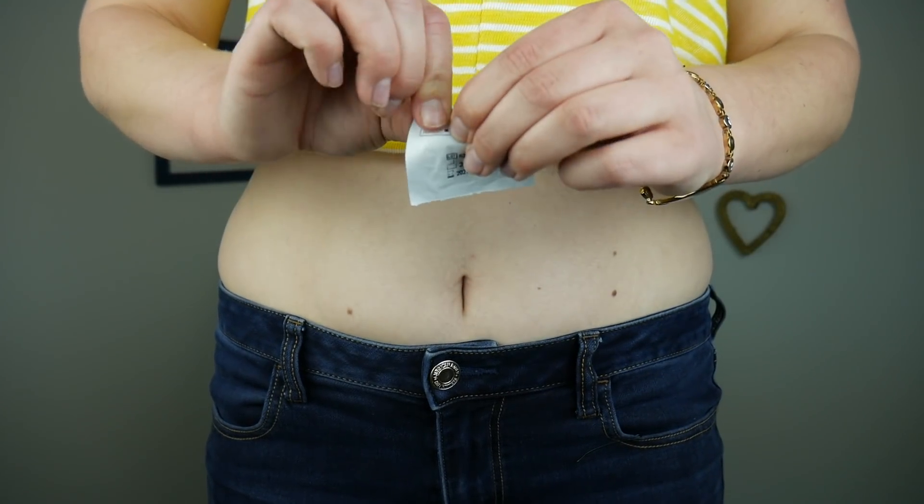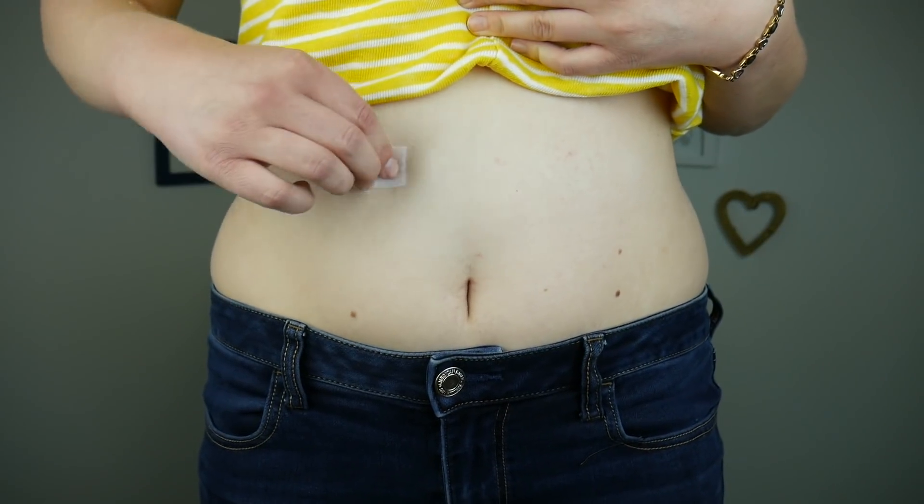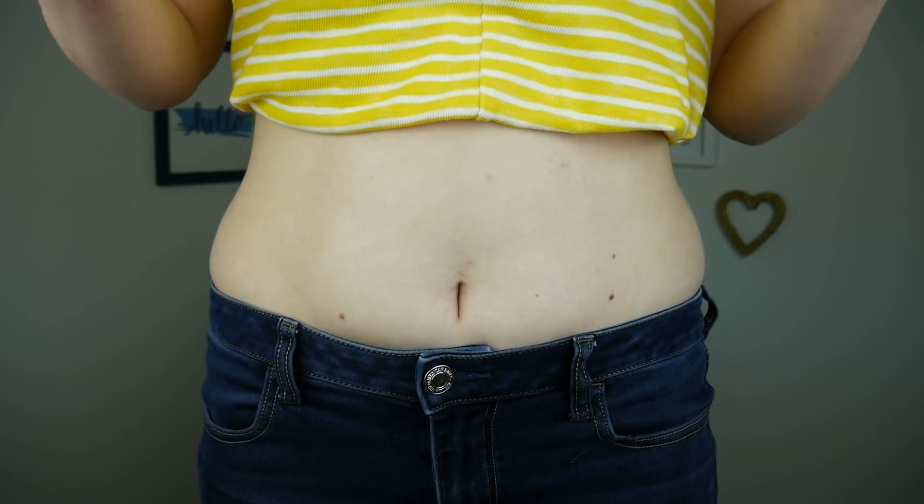So first you just want to clean the site with alcohol and let that dry. Now I have to enter the sensor serial number into my app or receiver, and it's just written on the very bottom of the adhesive backing, so I can either take a picture of it or enter it in.